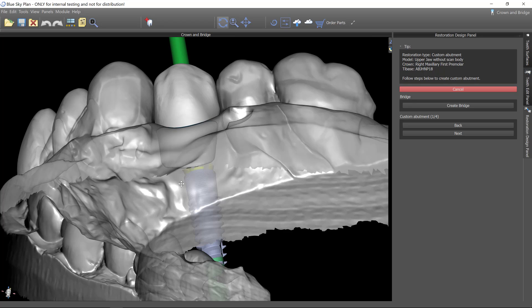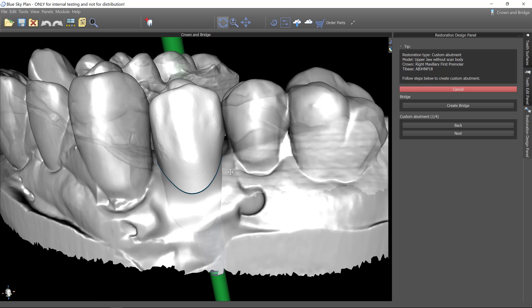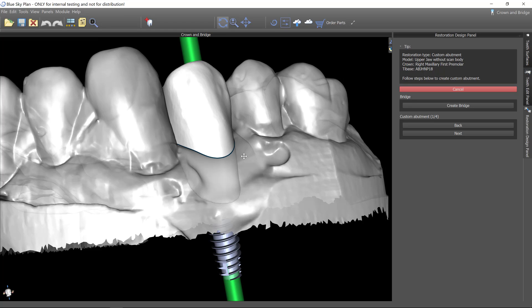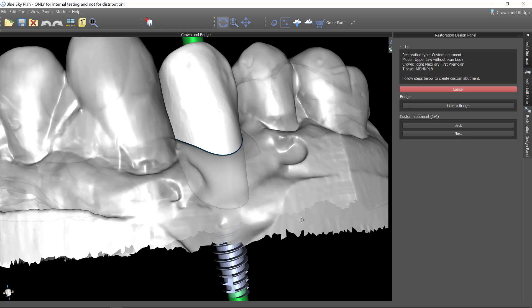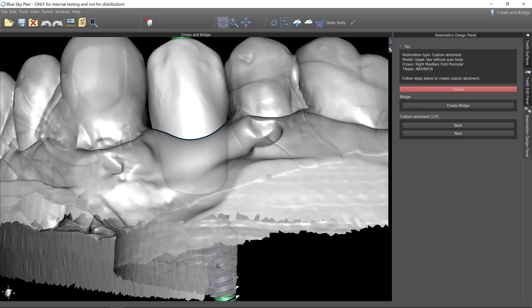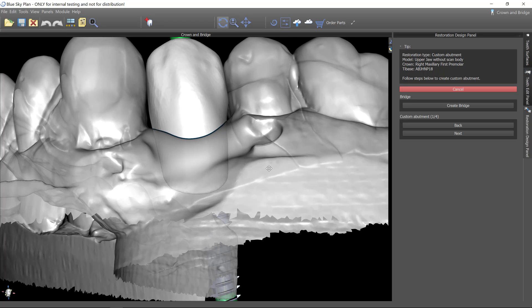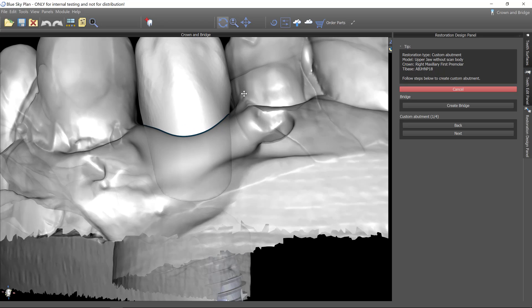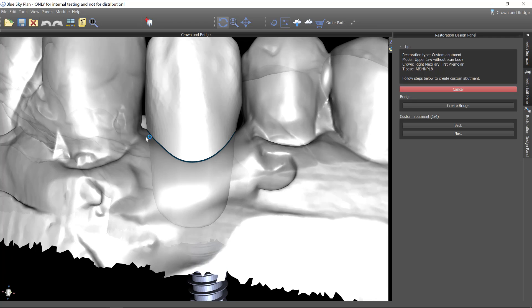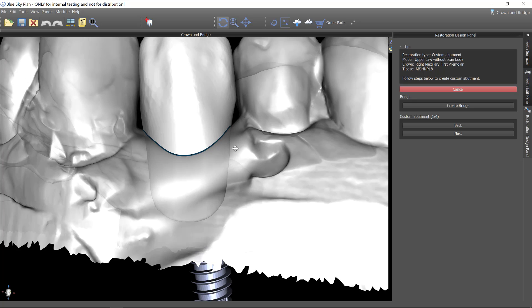Right now, if we were to just proceed as is, the custom abutment is going to be following right at the gingiva. And I like to design these the way that Danny Doming showed me forever ago to do these, which is to have a facial margin that is about half a millimeter subgingival. That way, for aesthetics sake, if you have a little gingival recession, it's not the end of the world. And then mesial and distal would be equigingival.